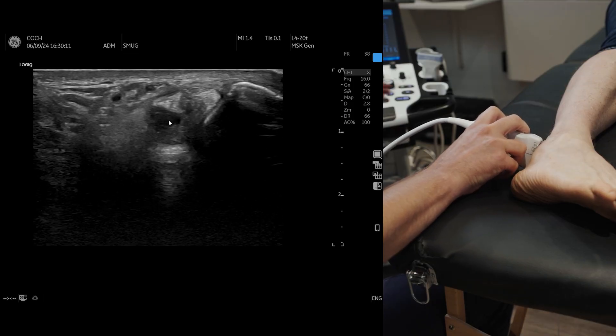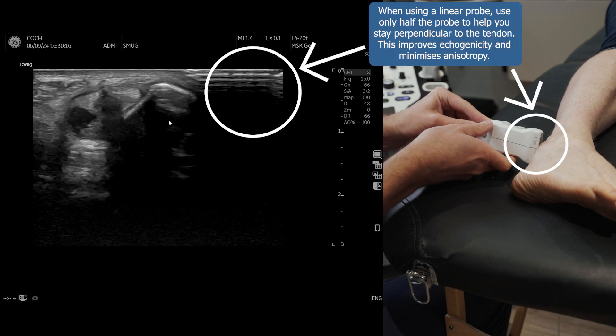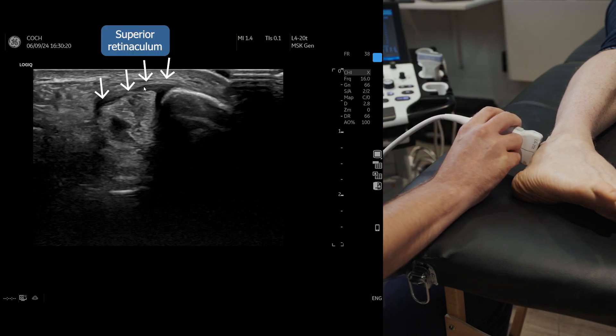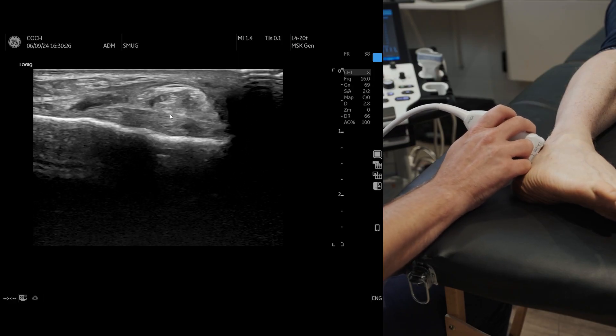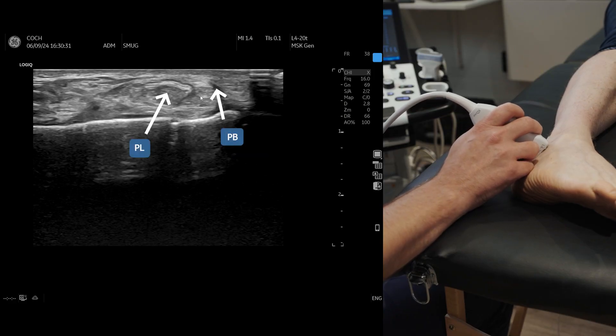You will lose contact as you come round, so you've got to keep moving the probe, because it really is right underneath that bone. As we come round and keep tilting, there's your superior retinaculum. Then as we come round, we can see the peroneus brevis, peroneus longus, and then the CFL underneath. We've got another video for the CFL.